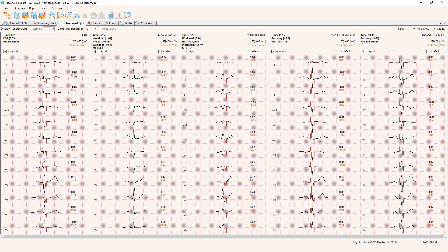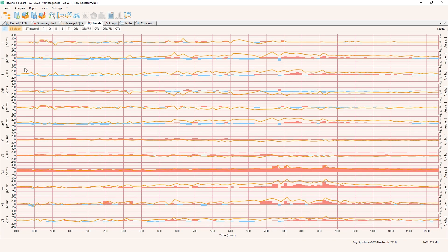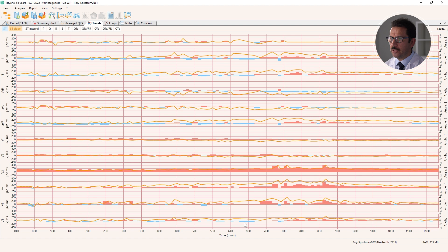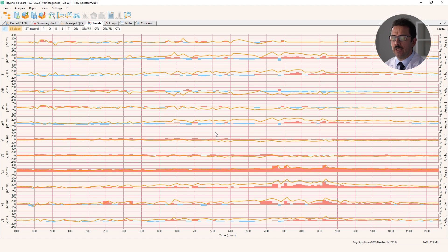I proceed to the trends window. I switch off the integral. The two main reasons to view this window are to see ST dynamics and ST slope. The blue marked part is ST depression, the red marked is ST elevation, and the orange line shows whether the ST depression is upsloping, horizontal, or downsloping. Horizontal or downsloping ST depression is a more significant ischemic sign.